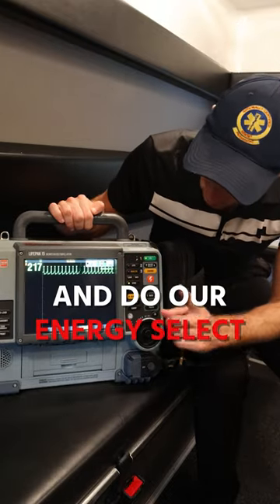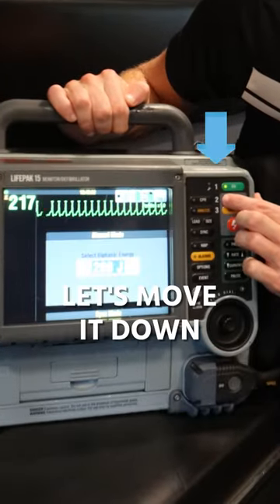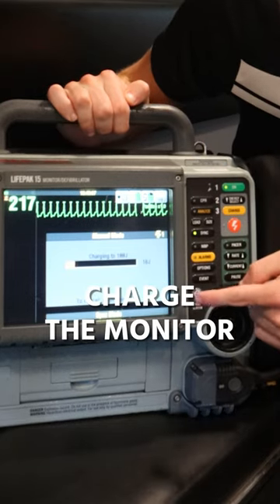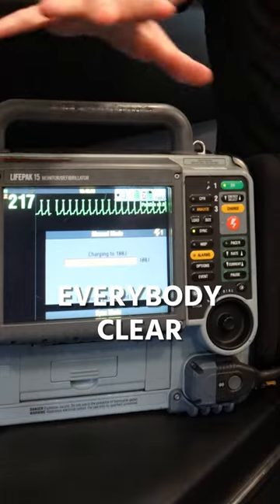From here we go to energy select, move it down to 100 joules. Now we're going to charge the monitor — charging, everybody clear, I'm clear.